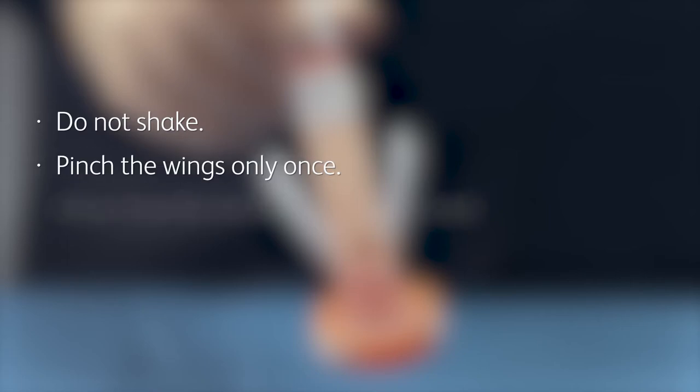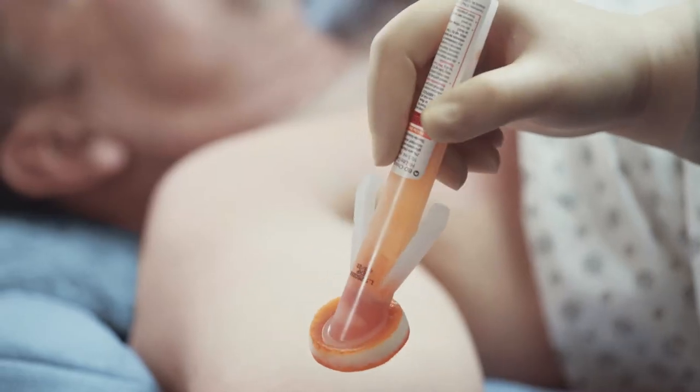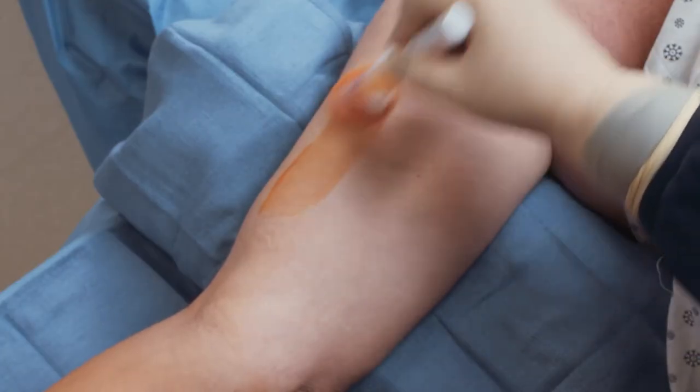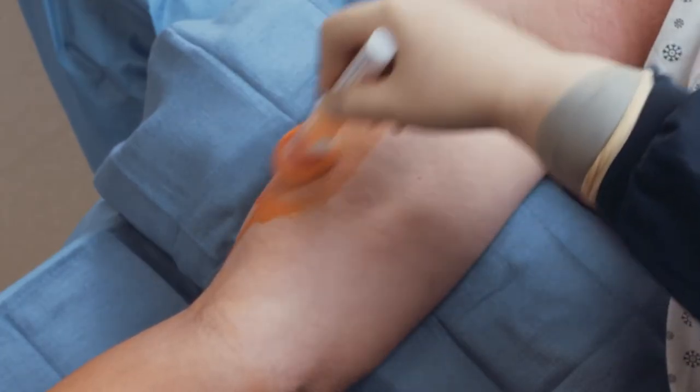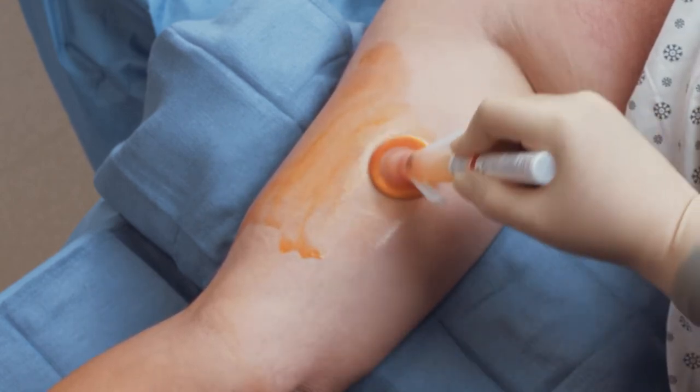Do not shake or pinch the wings multiple times. Allow time for the solution to partially load into the sponge. The applicator's unique design controls the flow of the solution for smooth delivery. With the solution now partially loaded, gently press the applicator against the treatment area to distribute the solution throughout the sponge.